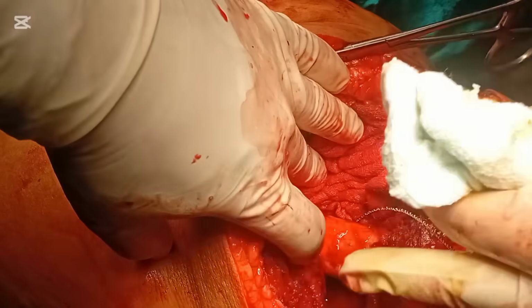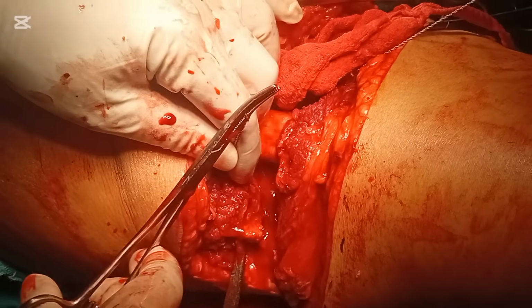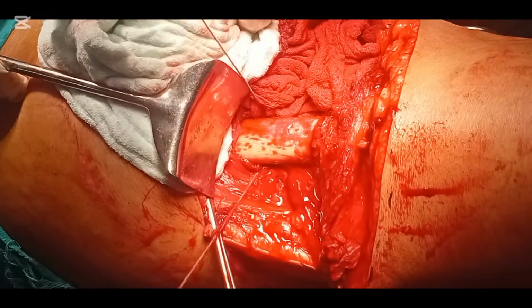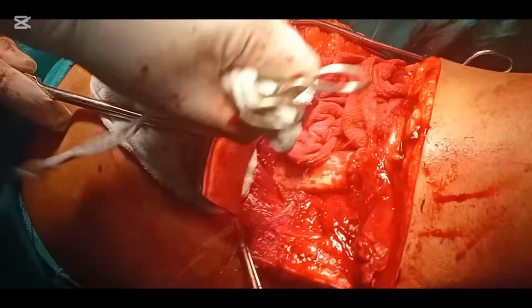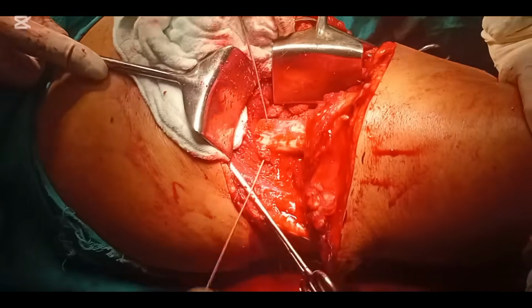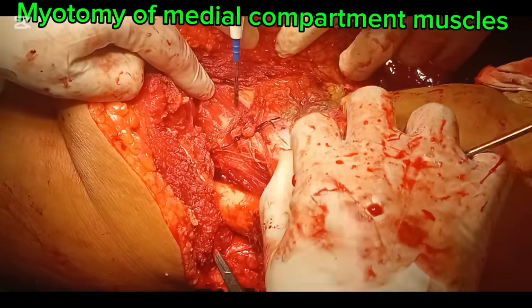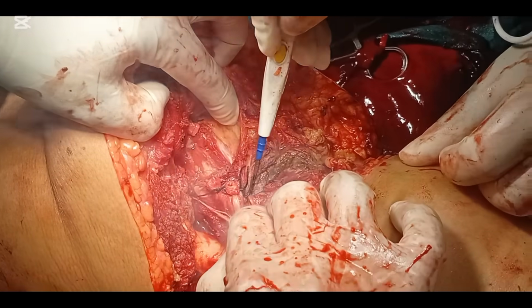We have separated the periosteum and now we use the Gigli saw. It is used to cut the bone. People use a bone cutter instead of it. Gigli saw is frequently available and it is also disposable, so you can use a new one. Assure that the distance between one and the other part of the Gigli saw is at 90 degrees. Bone has been cut and now we are on the medial compartment.